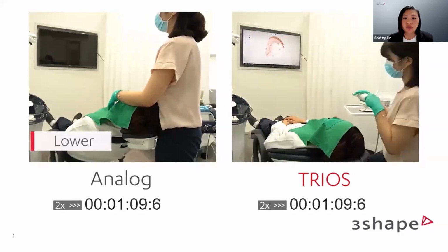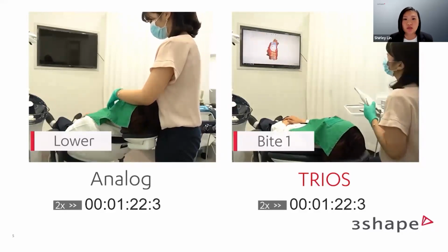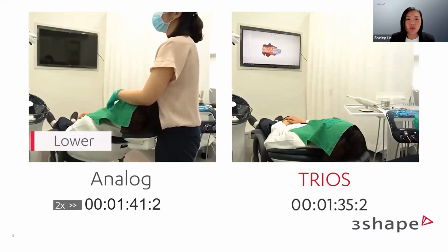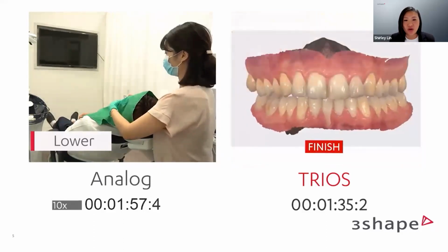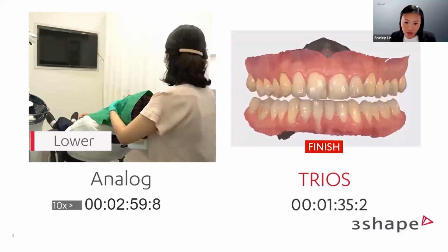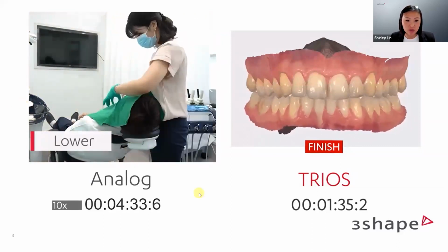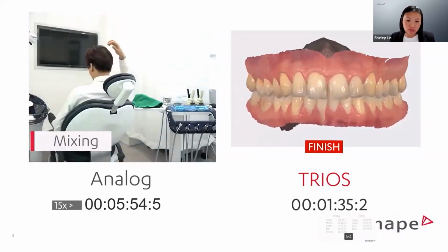All right, so she's done with the upper now, and now she can move on to her bite. So now that the software has both of those arches, we can align a bite after you've taken that. So you can see the bites are aligned and we're still on our lower analog impression setting. So I am going to skip through this. Now that's going at a 10 times speed. But the Trios intraoral scanner impression is finished, and they're still waiting on that set time for the lowers. I'm just going to skip through and it's going to give you an overview of the time between the two.